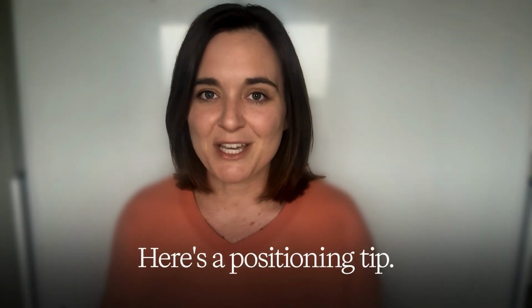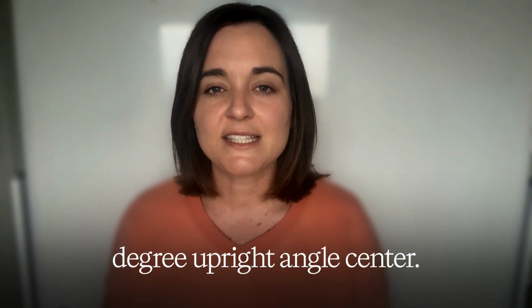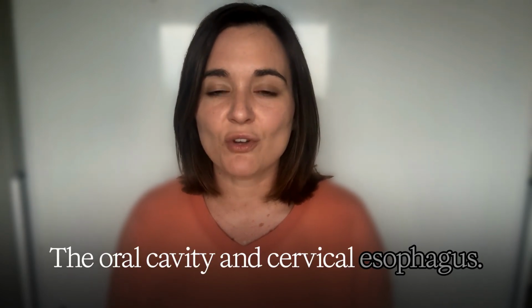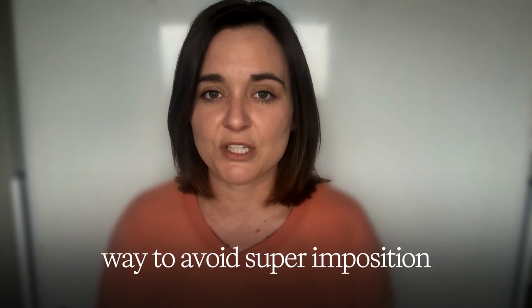Here's a positioning tip. Seat the patient at a 90-degree upright angle. Center the oral cavity and cervical esophagus. Keep the shoulders out of the way to avoid superimposition.